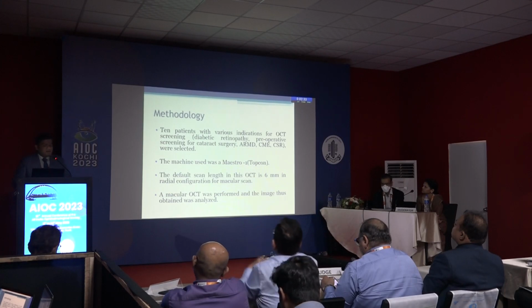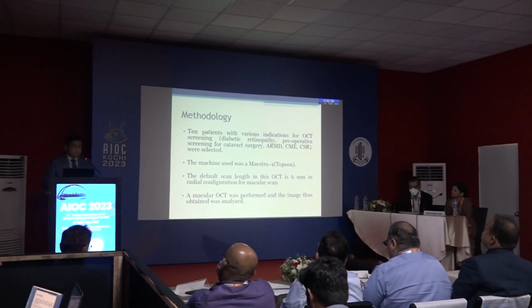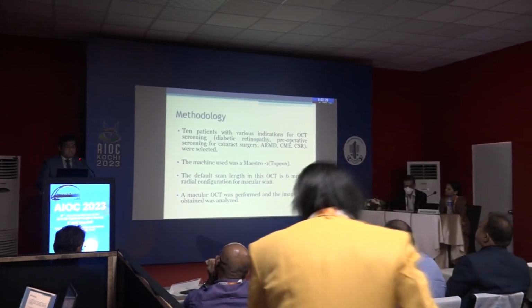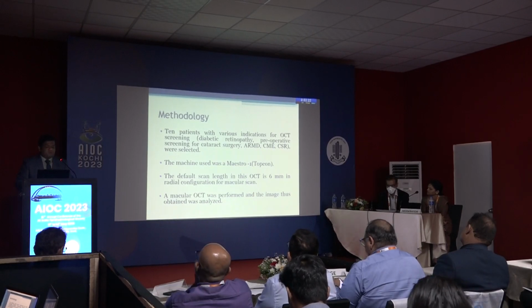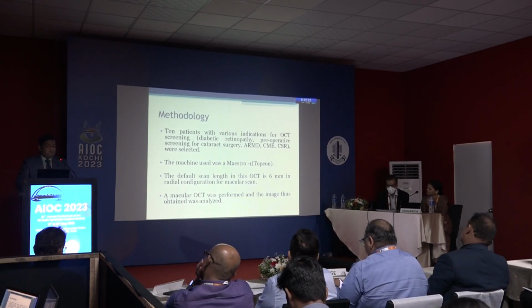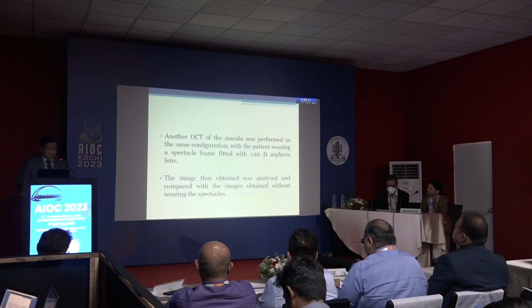Thus, we did a study where 10 patients with various indications for OCT screening, which included diabetic retinopathy, preoperative screening for cataract surgery, ARMD, CME, and CSR were selected. The machine which I used was a Topcon Maestro 1. The default scan length in this OCT is 6 millimeters in the radial configuration for the macular area, and the macular OCT was performed. The image thus obtained was analyzed.